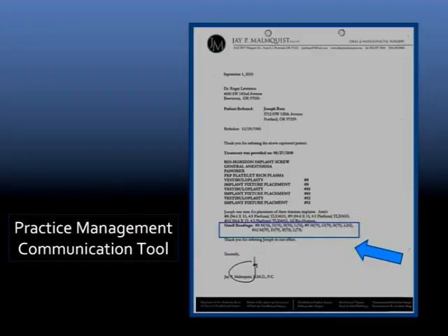I'm obviously in private practice, and one of the things I do is send back a letter every time I treat a patient. In that letter now I include a listing of the ISQ readings for that particular patient. I've educated the people that refer to my practice as to what these mean and what they can expect from the numbers. Obviously, there's not a consensus, and there probably won't be after this evening, but there's a certain level where we're very comfortable with the numbers.